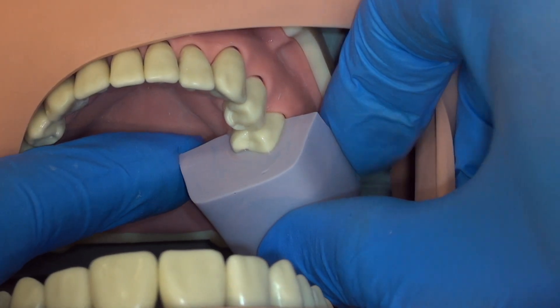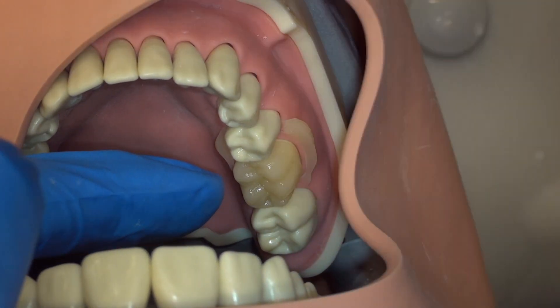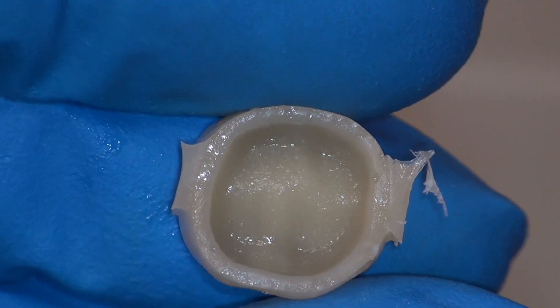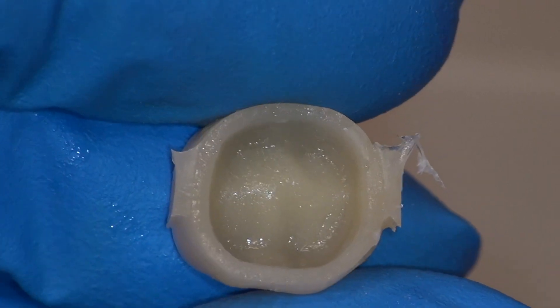When the material is firm but still flexible, we remove the putty by peeling it off. This ensures that the temporary stays on the tooth intact, and we can remove it carefully with a hemostat and gauze. Evaluate the internal surface and the margin and make sure there are no significant voids.